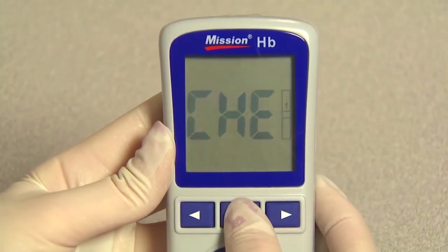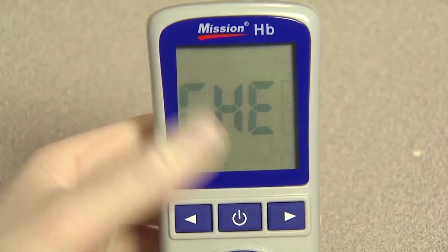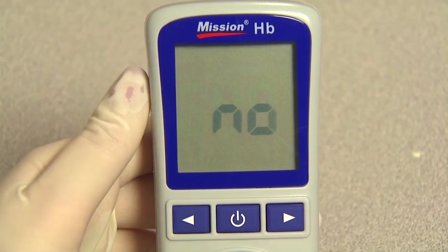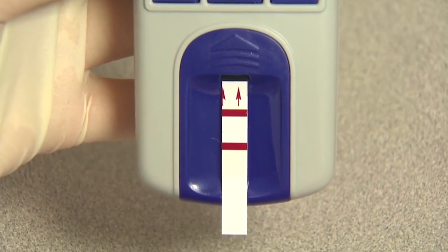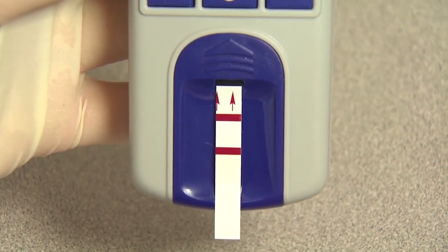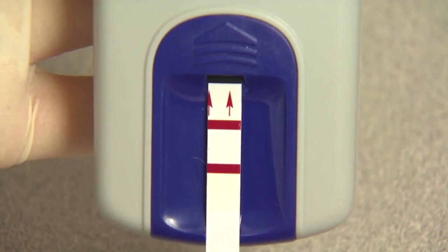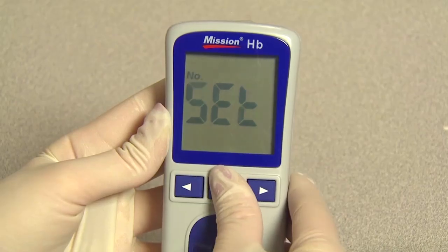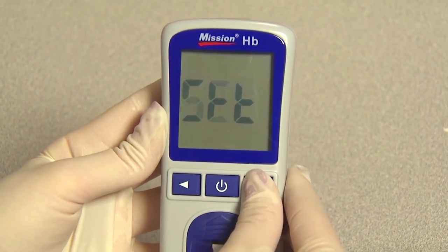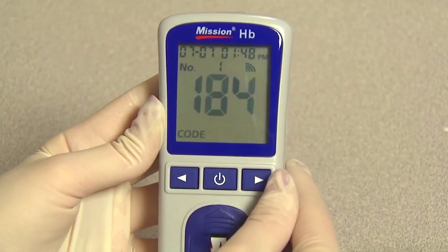If the meter displays yes, the meter is normal. If the meter displays no, the meter is not functioning properly. Check the control strip for contamination or damage. If there are any visible signs of damage or contamination, discard the control strip and retest using a new one. Press the power button to return to the setup screen, or navigate to the ELT screen and press the power button to return to the testing screen.